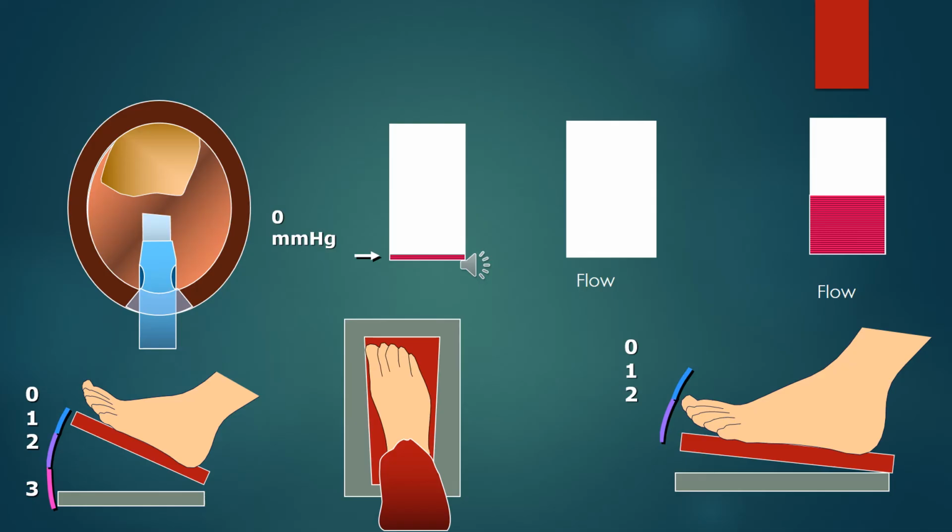Here occlusion means, in simple language, it blocks the Phaco tip. At that point of time, when it blocks the Phaco tip fully, there will be no flow because you have blocked the Phaco tip. It will have no place to draw fluid then. At that point of time, does the pump stop rotating? No, the pump doesn't stop rotating. The pump goes on rotating because it has to generate the vacuum. How much vacuum will the pump generate?